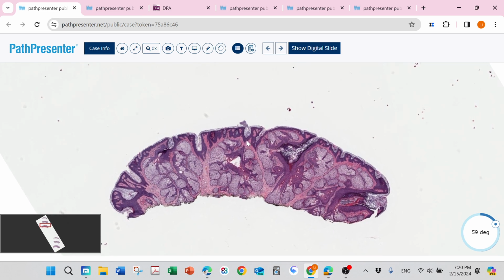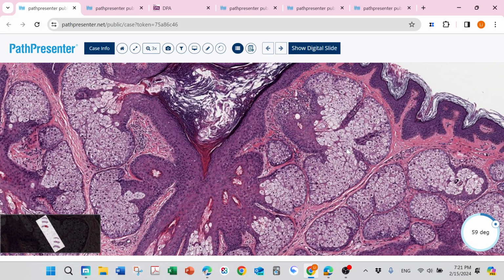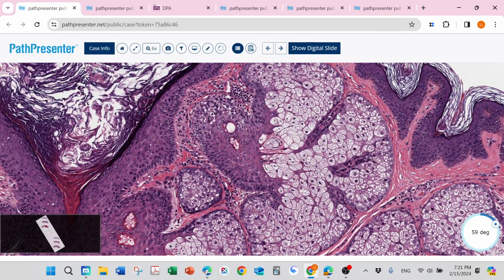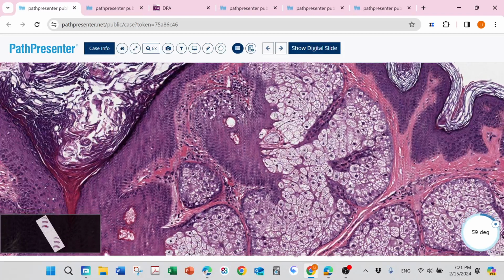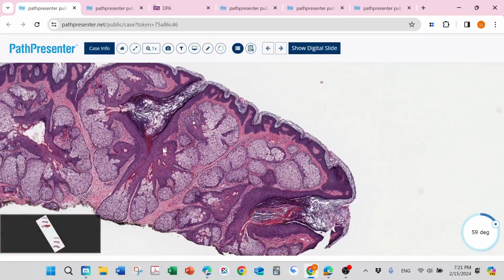First, for sebaceous hyperplasia, this sebaceous gland is just hugging a hair follicle. And then when we have high power, we can see most of these structures are just sebaceous cells. And then in the periphery, we do not see germinative stem cell. That means germinative stem cell, just like this cell, usually in sebaceous hyperplasia, is just a single layer of this hyperchromatic basaloid cell. If we have several multiple layers, that is at least sebaceous adenoma. So this one is just sebaceous hyperplasia.